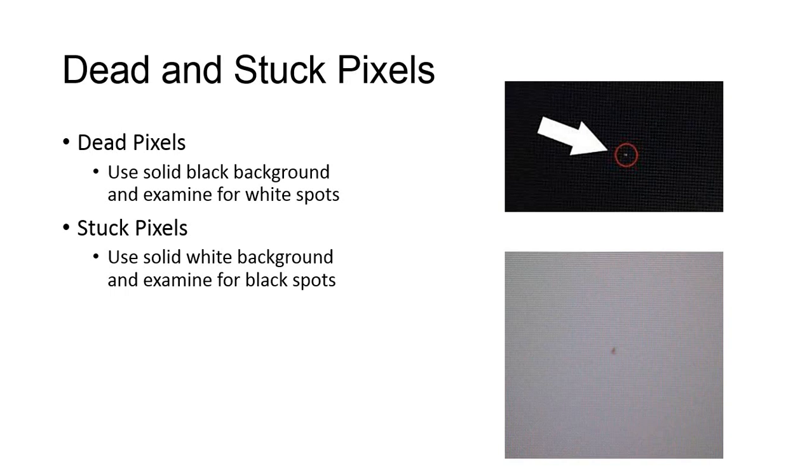The AAPM recommends for Class 1 monitors used for diagnosis, 3 conditions must be met. 1. 15 or fewer bad pixels must exist across an entire screen. 2. There must be 3 or fewer bad pixels within any circle of 1 centimeter diameter. And 3. There must be 3 or fewer bad adjacent pixels.